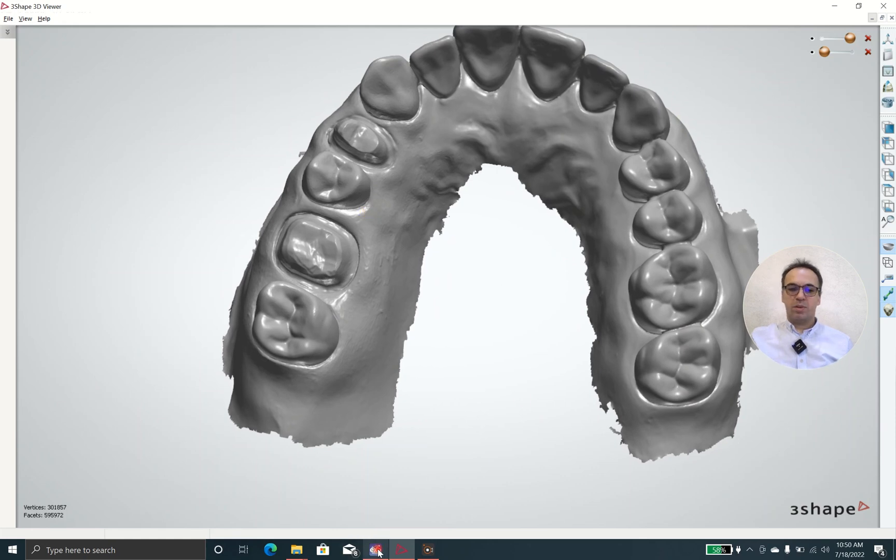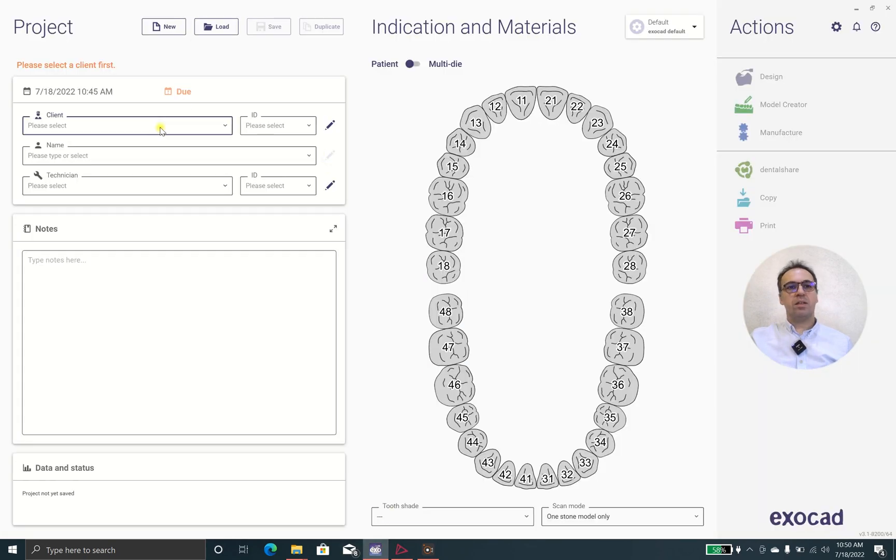We are going to Exocad and we are choosing New. The client is myself and we name it Demo Bridge Exocad 3.1 and set the technician as myself of course.